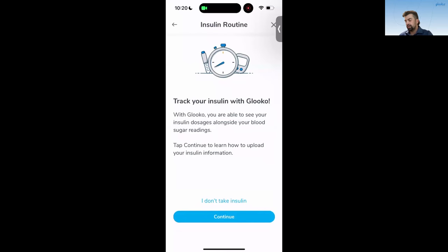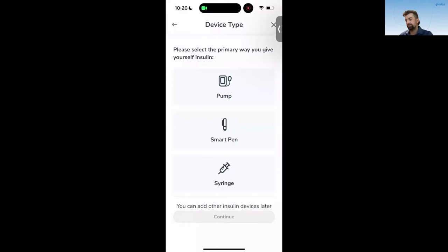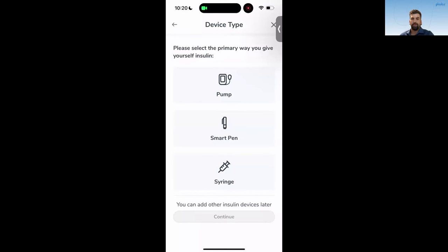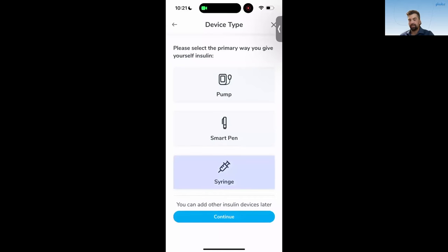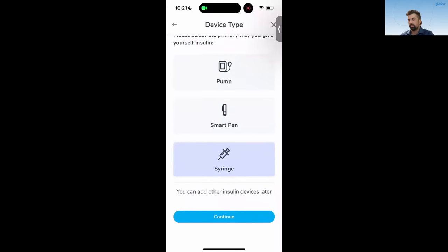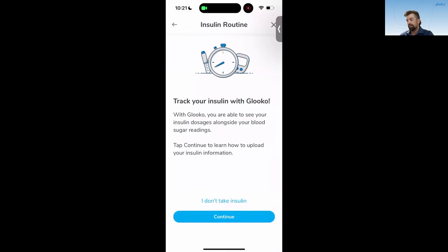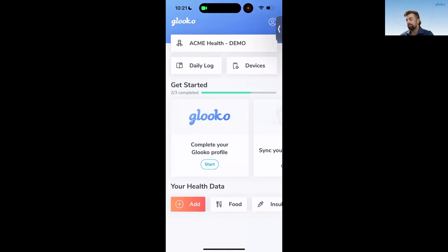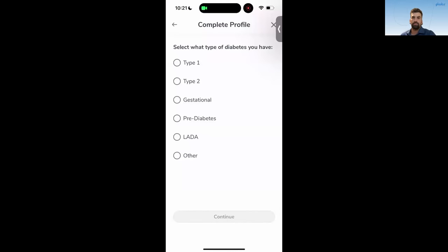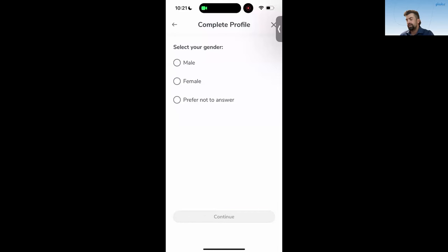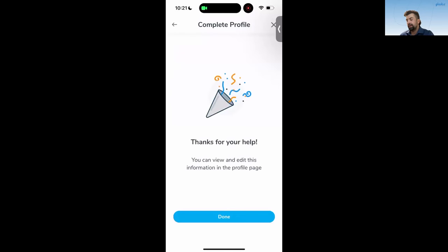For the tracking insulin goal, this walks users through a similar device-narrowing setup. We ask the user if they're on a pump, a smart pen, or syringe. If they're on a pump or pen and have a compatible device and sync it, that goal will be completed. If they just manually take injections, they can go to the add event screen for insulin and the goal would be completed there. Or if the user doesn't take insulin, they can indicate that and the goal would also be completed. We're also collecting some basic demographic information from the user — this will help us target with different communications we have planned for the future for better syncing adherence.